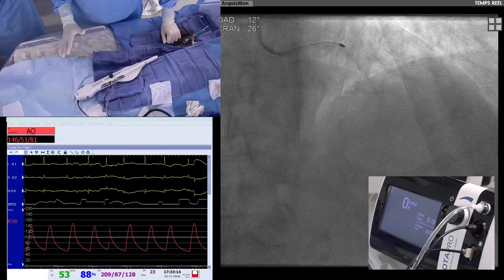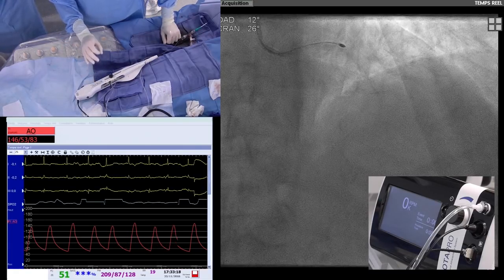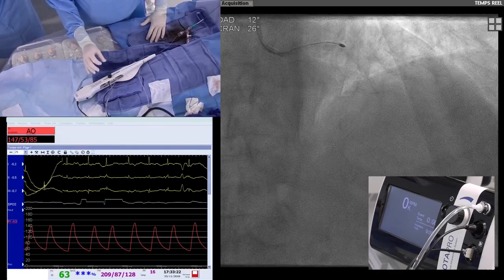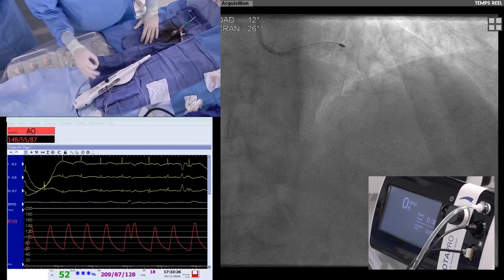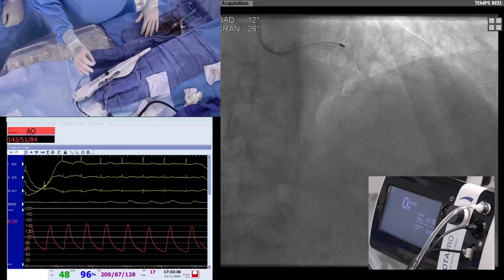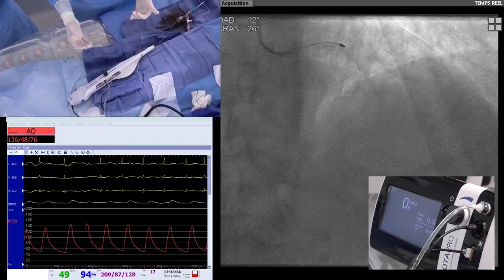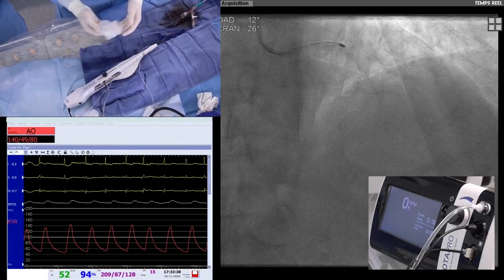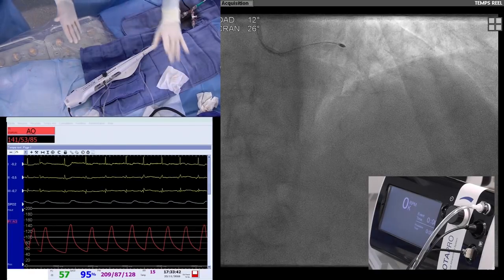And one advantage, I think, to the new ROTAPRO is you are doing everything with your right hand. So you have to pull back the burr first, and then you stop. Sometimes with the pedal you can do both at the same time, and you can stop the burr from running, and this increases the risk of burr entrapment, I think. So maybe it's a good option.